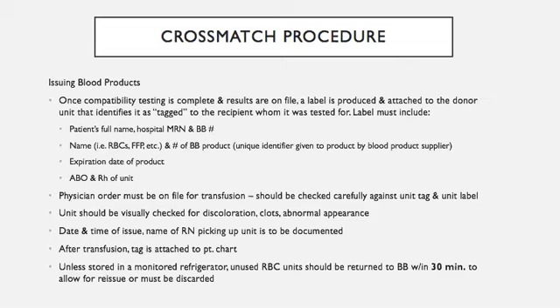Once that unit leaves the blood bank, unless it is stored in a monitored refrigerator, meaning that it has a calibrated thermometer in it that is monitored regularly and the temperature noted at regular intervals, any unused red cell units have to be returned to the blood bank within 30 minutes, if they're not used for whatever reason, to allow for reissue.